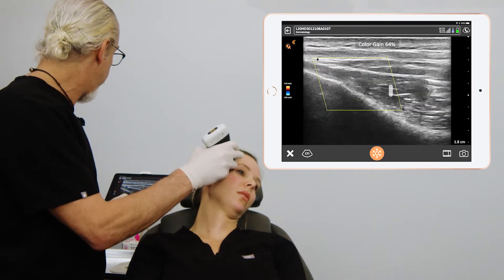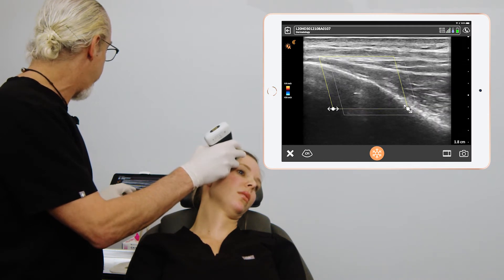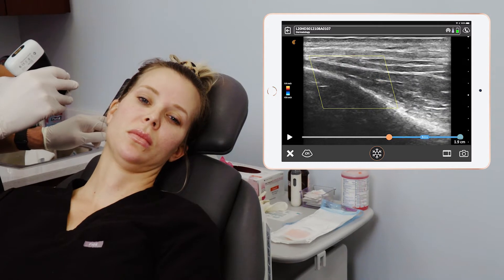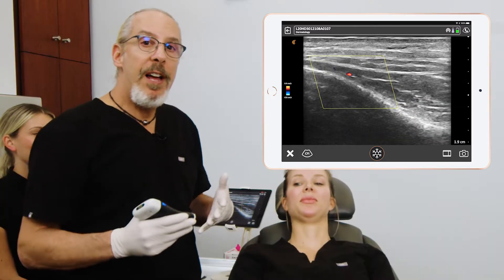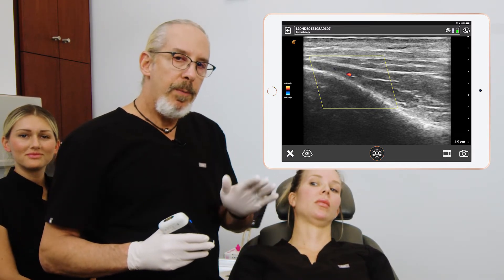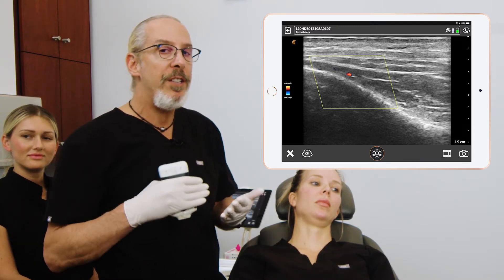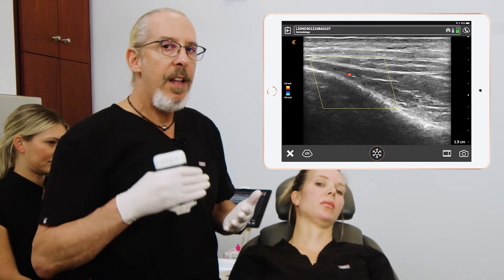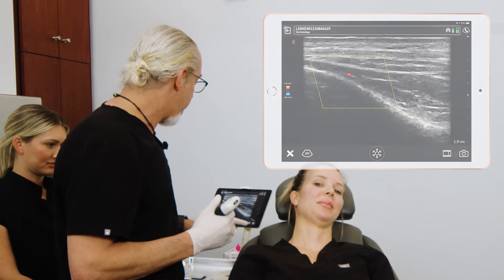With our injections, we're injecting superficially, so the deep temporal artery doesn't come into play. Now we've found the deep temporal artery — it's not quite on the periosteum, but our injections are going to be much more superficial to this. However, when you do those deep injections, finding the deep temporal artery is important, because those deep temporal injections can affect this artery. We'll screenshot that.